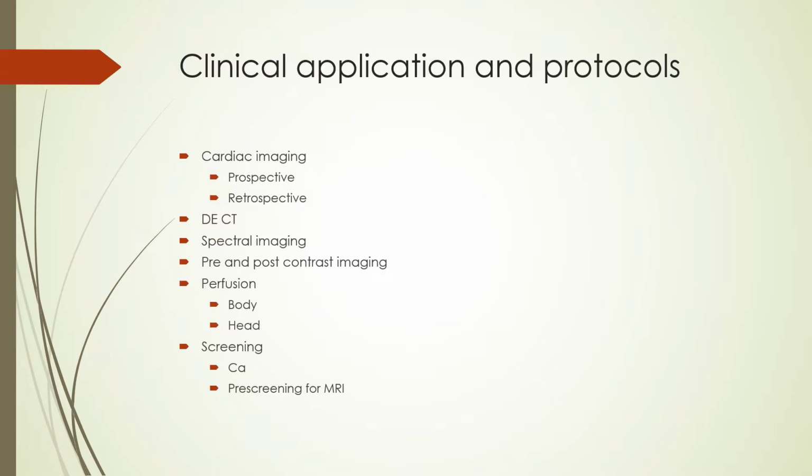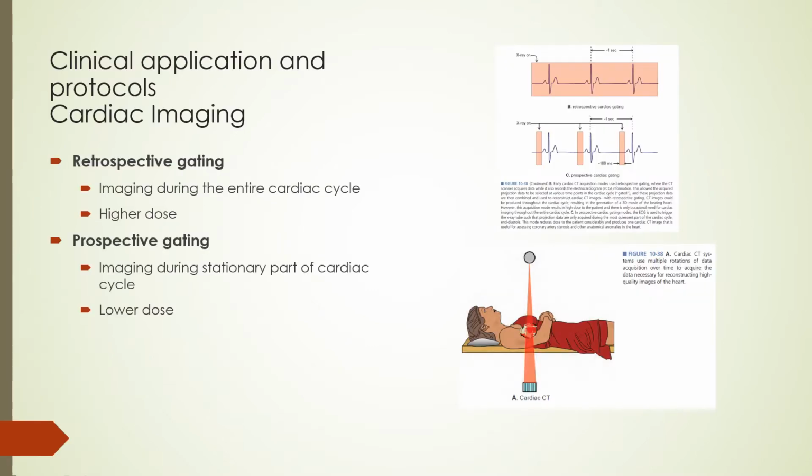A few clinical applications are listed on this page. We shall start with cardiac imaging and complete with some screening applications like calcium scores and pre-screening for MRI imaging. For diagnostic purposes, cardiac imaging with CT offers advantages over coronary angiography because it is faster and less invasive.